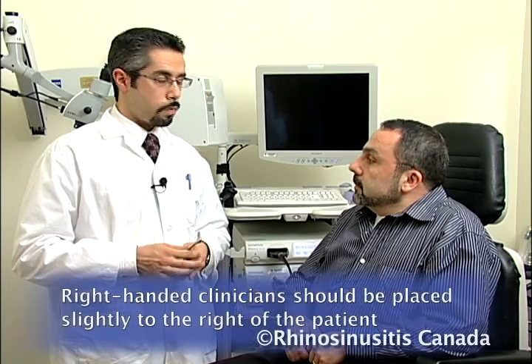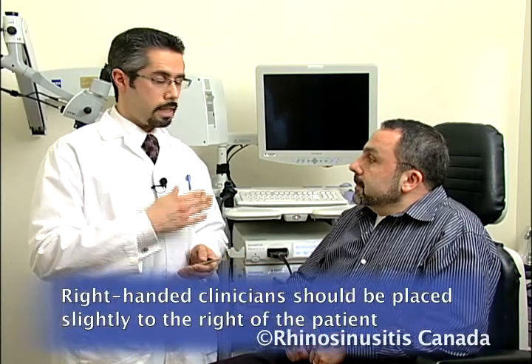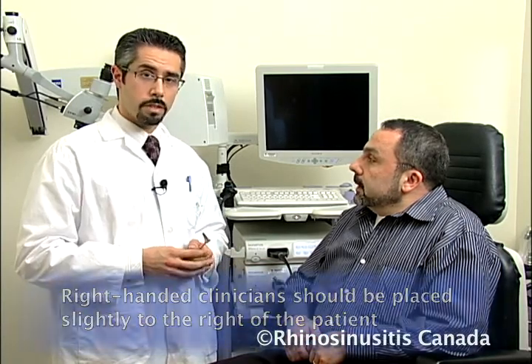For the nasal examination, the patient should be seated in front of you in an upright position with their head roughly at the same level as yours. This avoids the need to unnecessarily bend down and potentially strain your back. Right-handed clinicians should be standing on the right side of the patient.